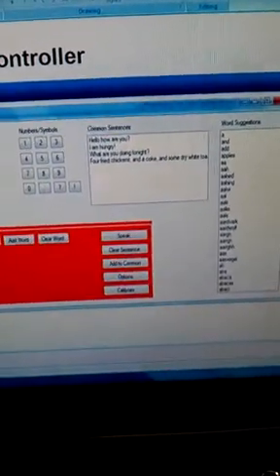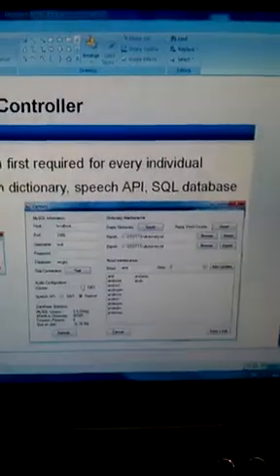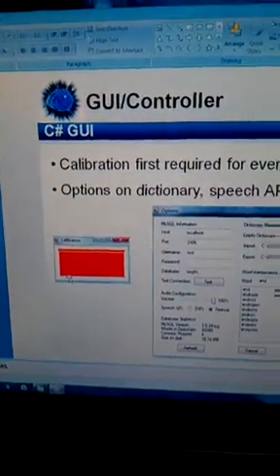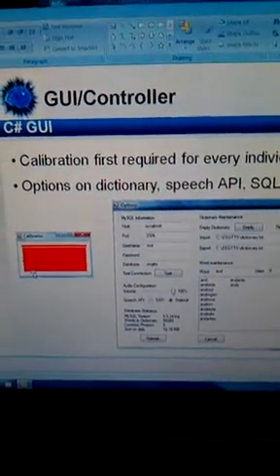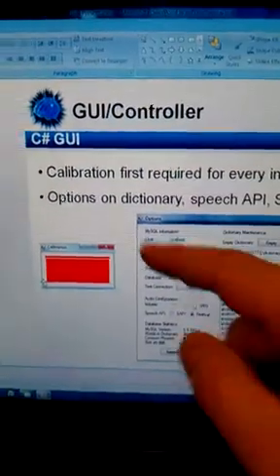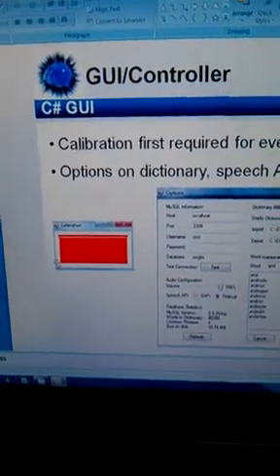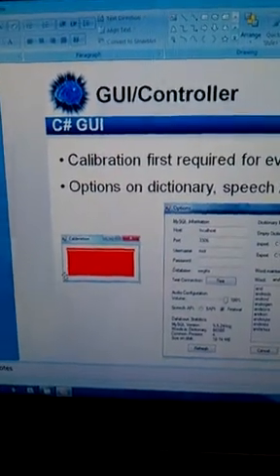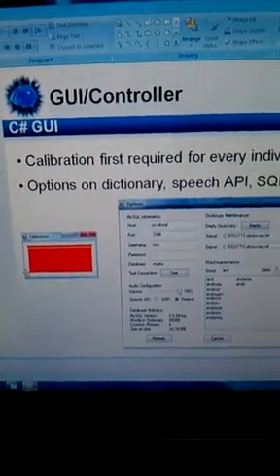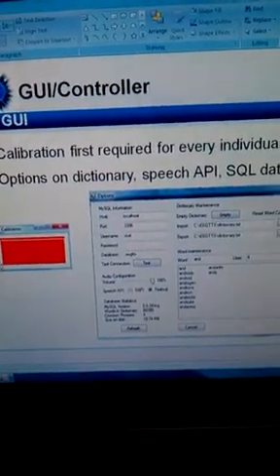up our word selection. Here we have something that will basically calibrate the system to each user that uses it. Those ERP waveforms are unique for each individual. So basically what we do is we have this little box here, and it's grayed out, and then it'll flash red 5 times, and then we average those when it's flashed and create an ideal ERP that we can correlate with the incoming samples and see if there's an ERP there.